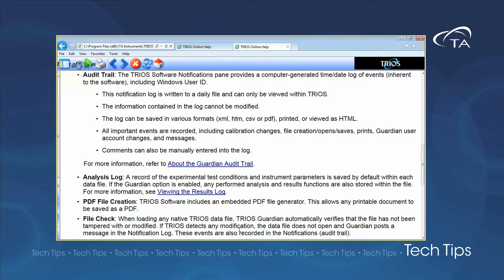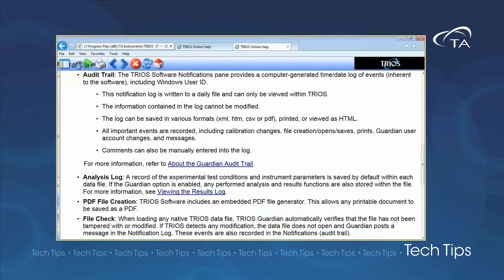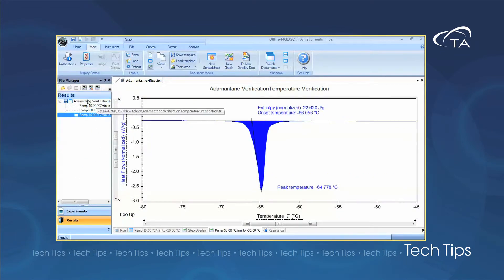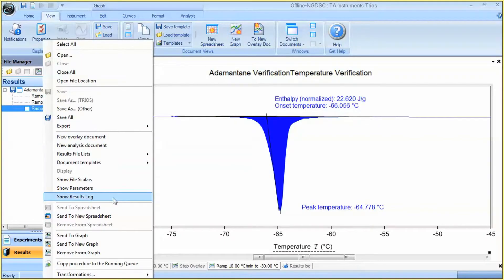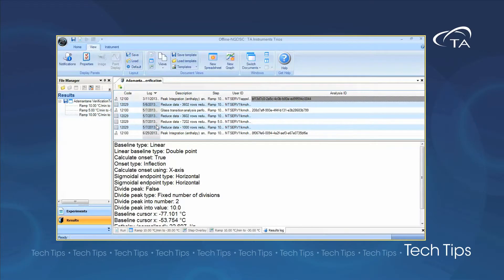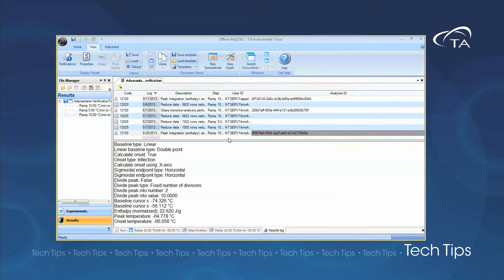Let's look at the data file within TRIOS to view the results log. Begin by opening the data file in the file manager window and then right-clicking on the data file name to select Show Results Log. With the results log open, you can determine the log date in which an analysis has been performed, the description of the analysis, and underneath the analysis ID, you see a detailed view of the analysis results.